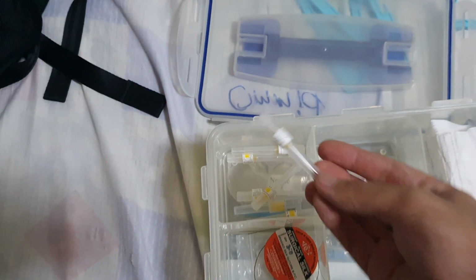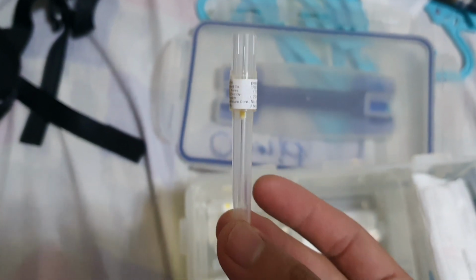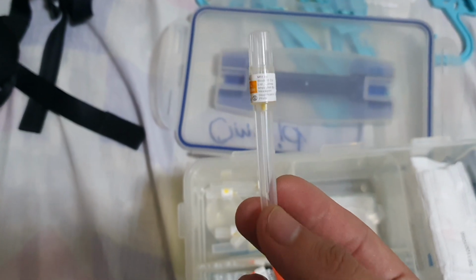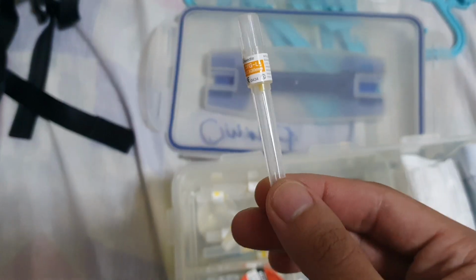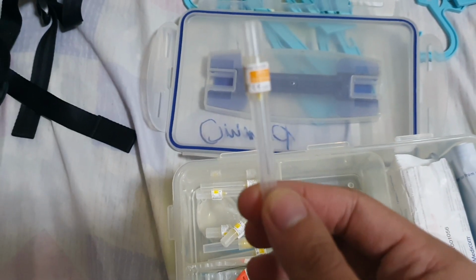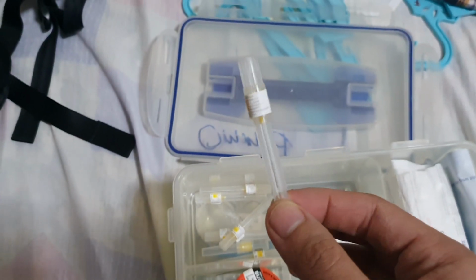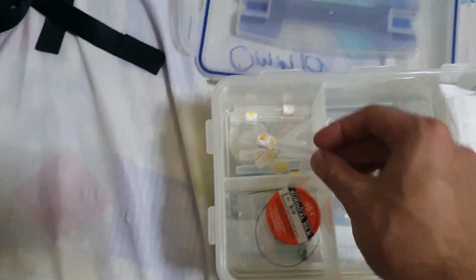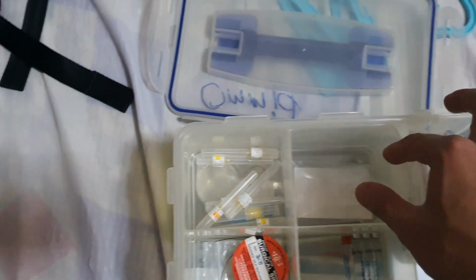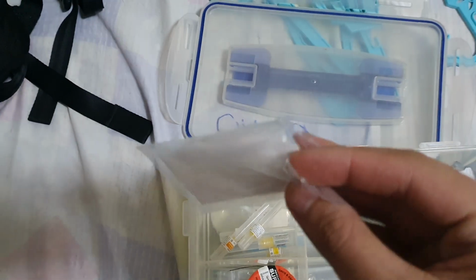However, the long needle is used for the posterior. Any posterior is fine. It's okay for the PSAN, and then the MSAN, that you can use for the injection of the anesthetic.